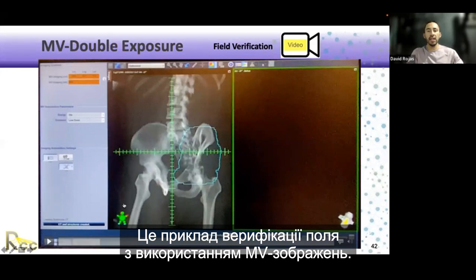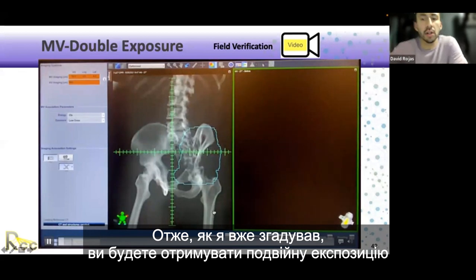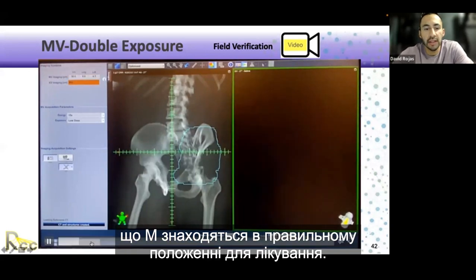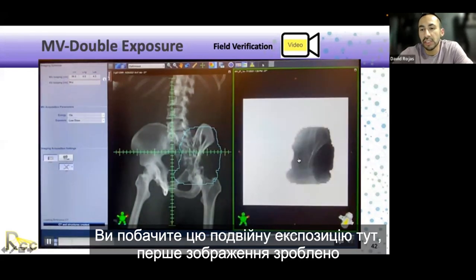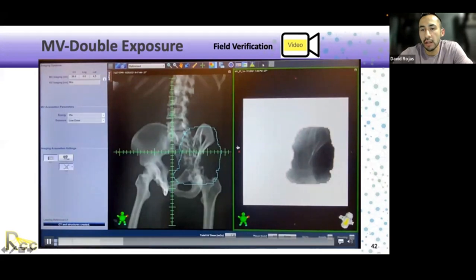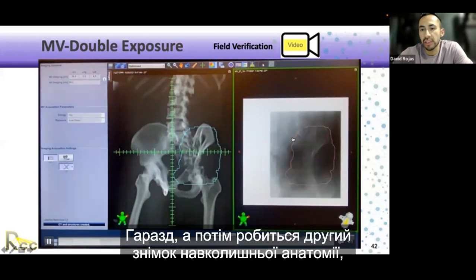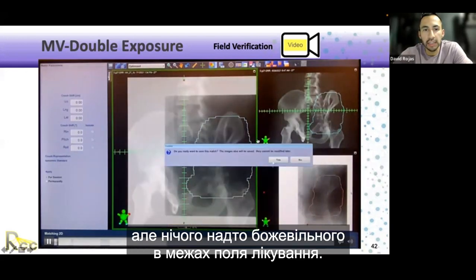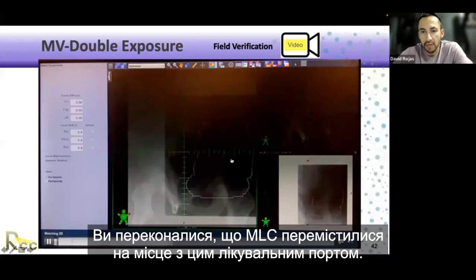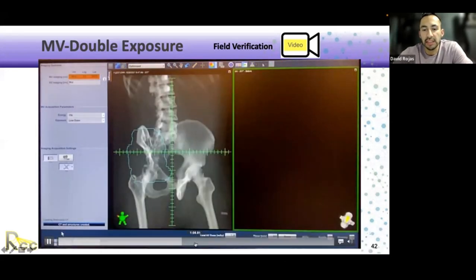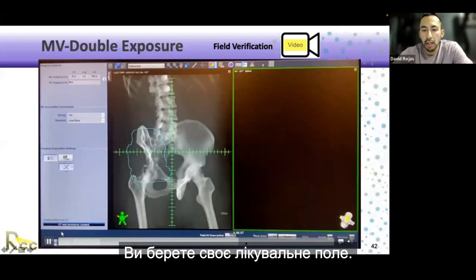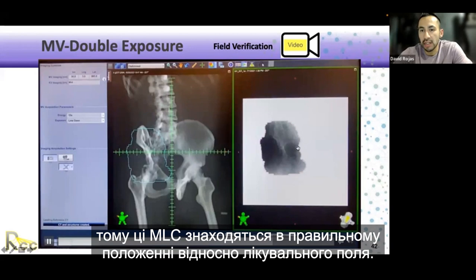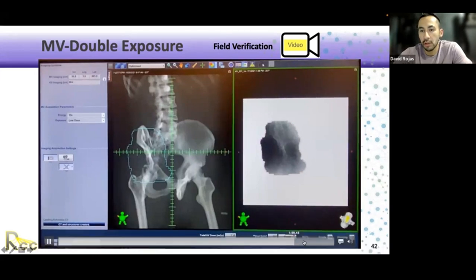This is an example of field verification using MV imaging. You're acquiring an MV double exposure to verify treatment fields and confirm MLCs are going into the correct position. The first image is taken of the treatment area, and then the second exposure is taken of the surrounding anatomy so you can verify position as well. You can verify that the MLCs moved into place with that treatment port. The image is acquired with your treatment beam, so the MLCs are in the correct position as far as the treatment field goes.